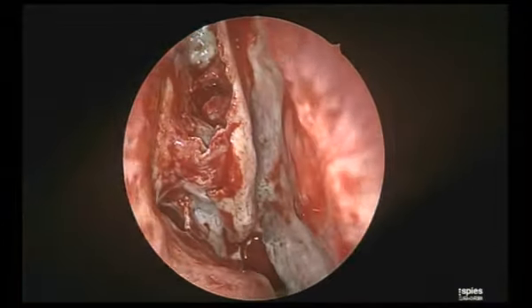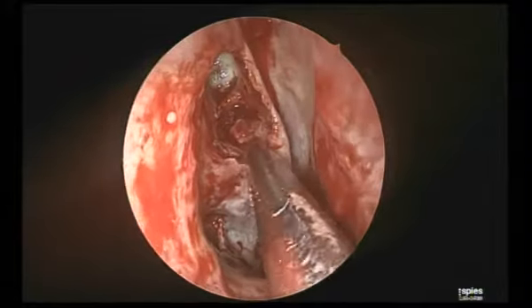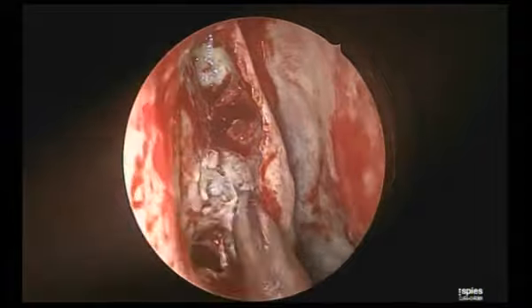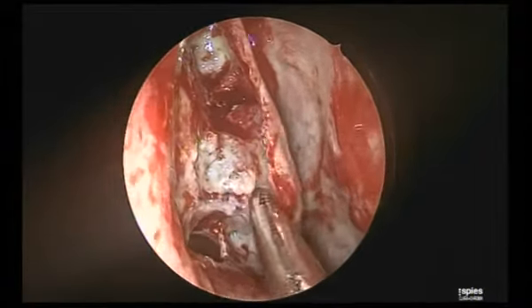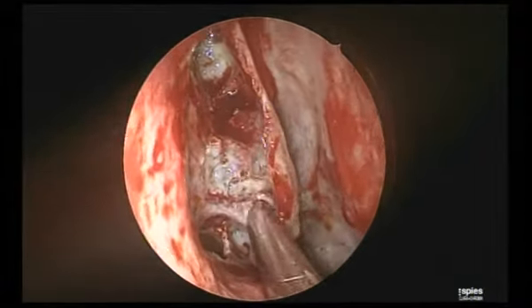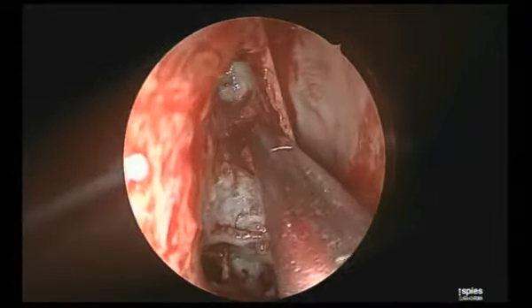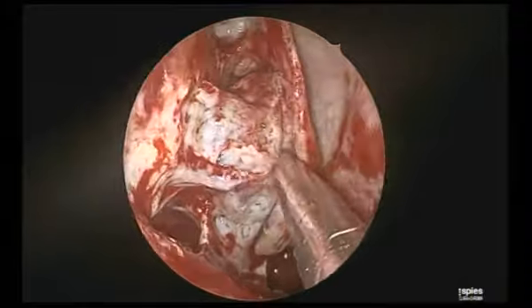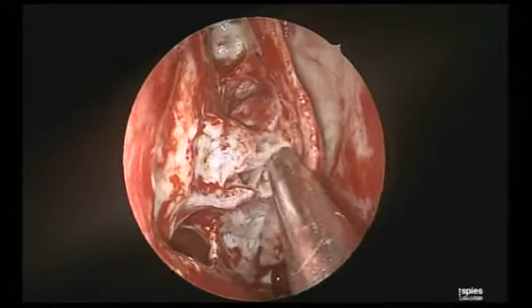Now I'll go with a straight blade. This is the lower part of the bulla. Tuck, tuck, tuck, tuck. I'm used to this 10 minutes philosophy in Jaipur. See now, this is your upper limit of the maxilla. I'll go in the posterior ethmoid.